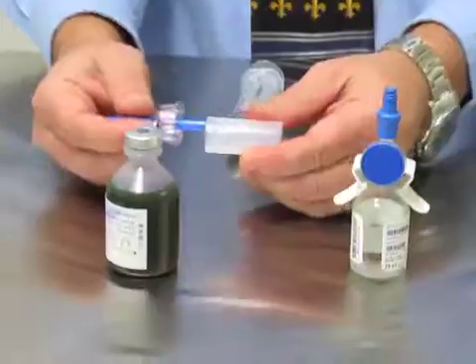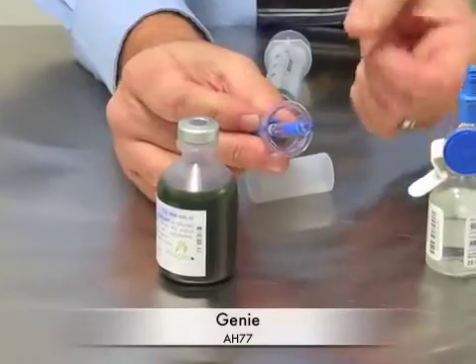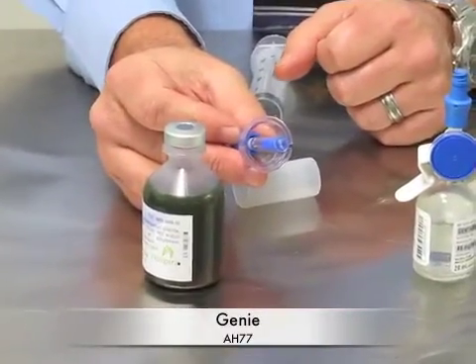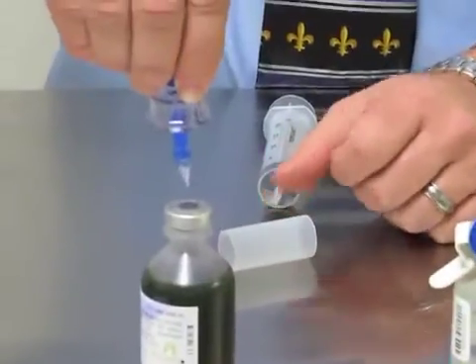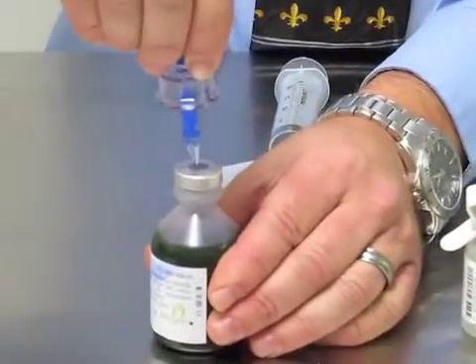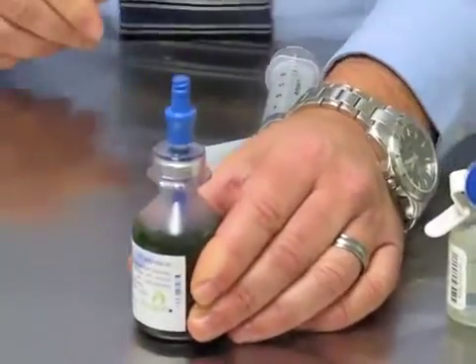The next vial adapter has a spike on the end and a balloon, which I'll show you in a second. To place this into the vial, you want to make sure you go straight down onto the vial, push hard, and lock on.